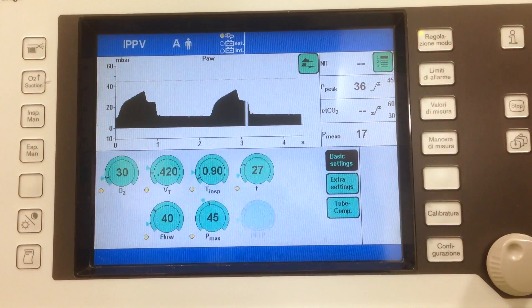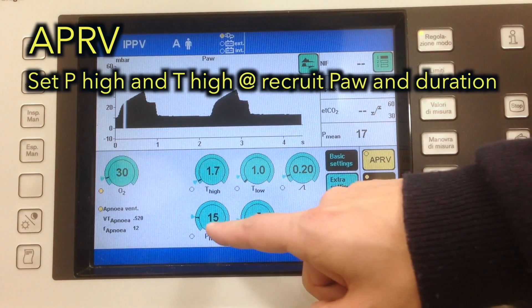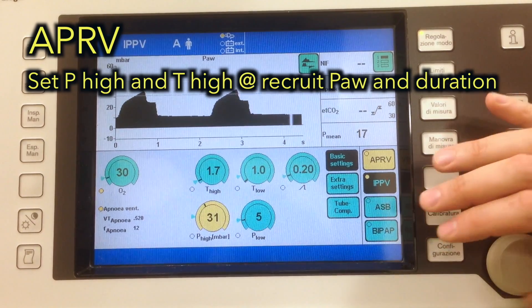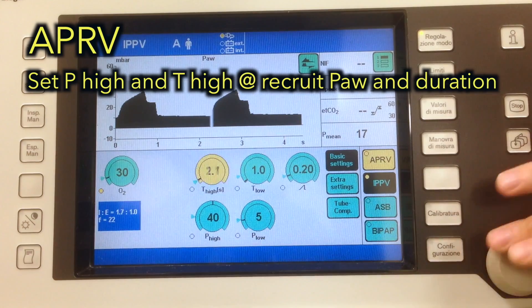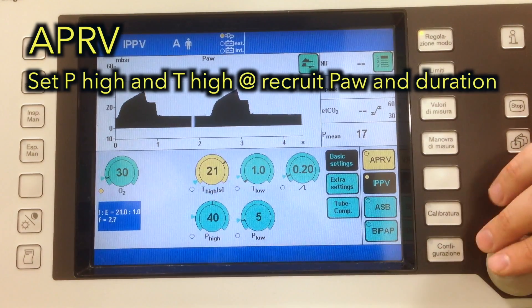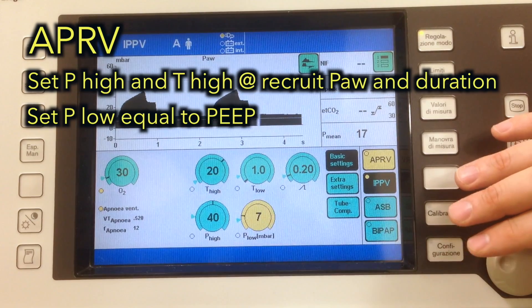To perform the recruitment maneuver, we take advantage of the APRV mode. Set the pressure high at the pressure we want to recruit at — so, for example, 40 in this case. We set the high time to the time we want to perform the recruitment for, so 20 seconds. And we set the P-Low equal to the current PEEP.